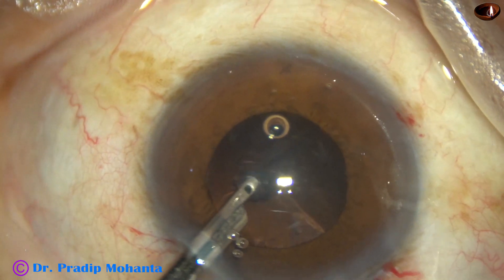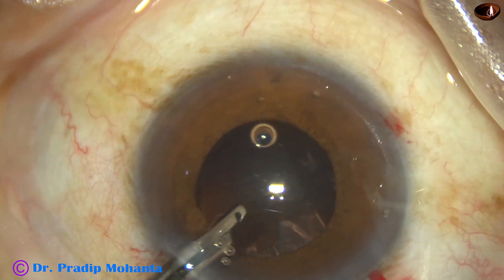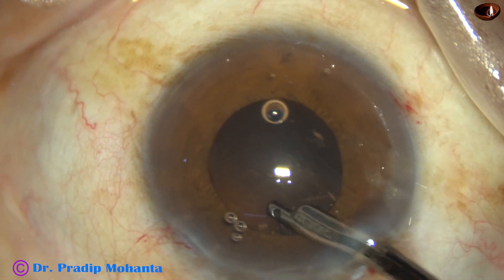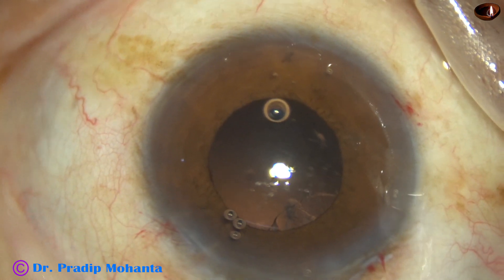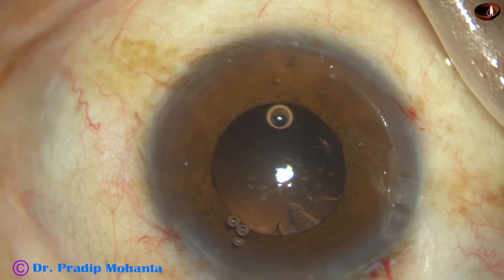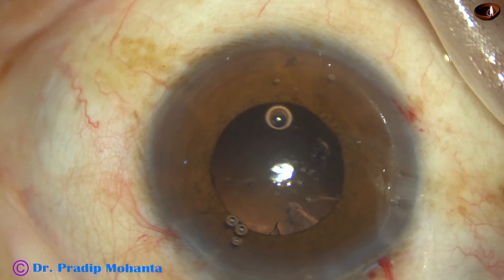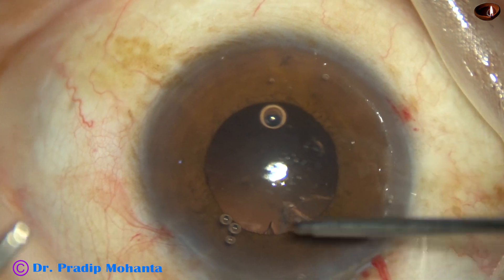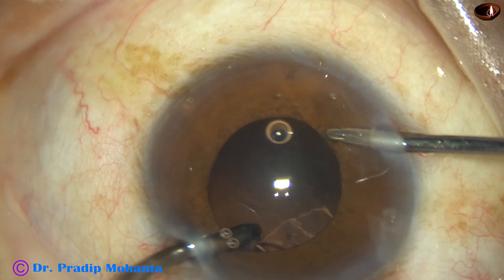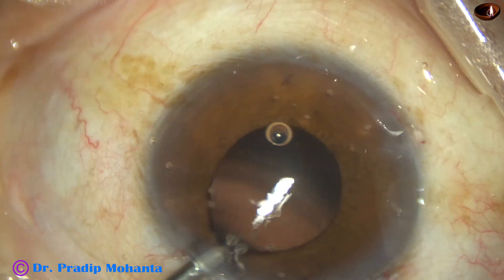In this case, there is some sub-incisional cortex which I will not be able to remove by the Simcoe. So I have asked for bimanual irrigation-aspiration. The irrigation is from the right side port, aspiration from the left, and the sub-incisional cortical matter is removed.